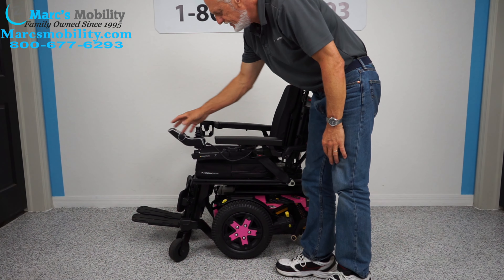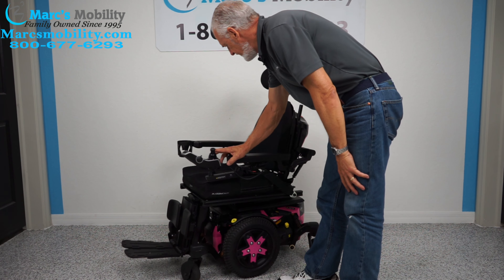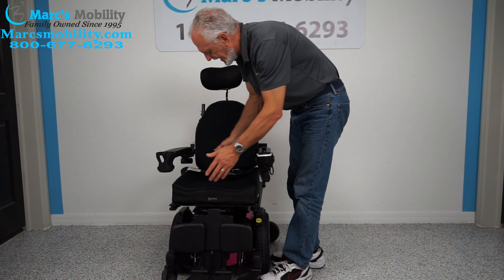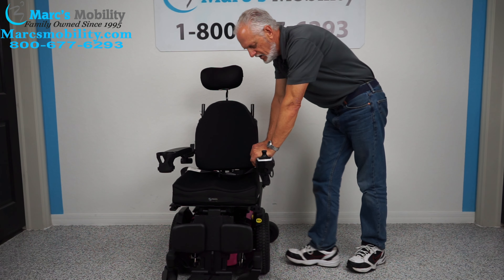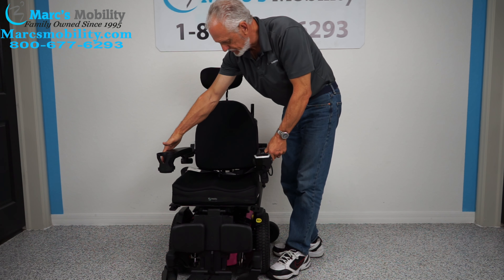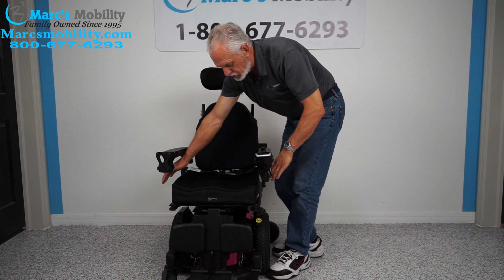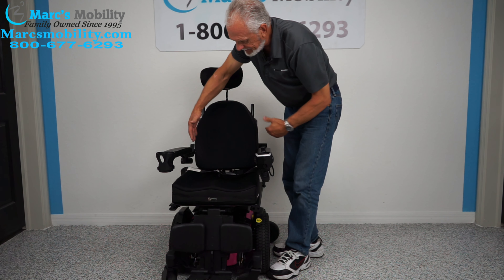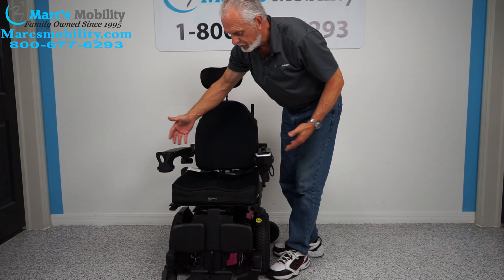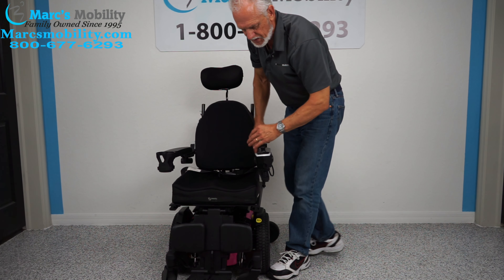The seat on this chair is 17 by 18 — 17 wide by 18 deep. Right now from outside of arm to outside of arm is 22 inches. If you put a 20-inch cushion and a bigger back on here, the arms are going to be at 24-25 inches — you might as well go with a full-size Quantum. But if you want to keep it at 22, you have to keep the seat fairly small.